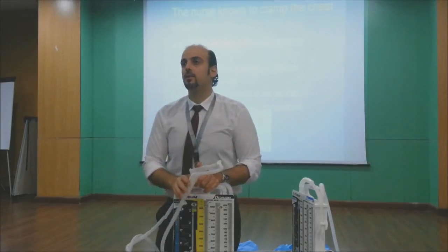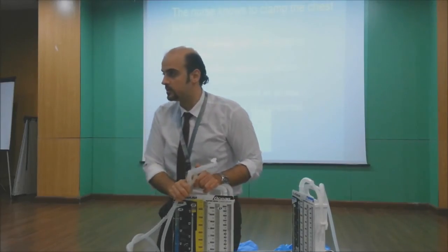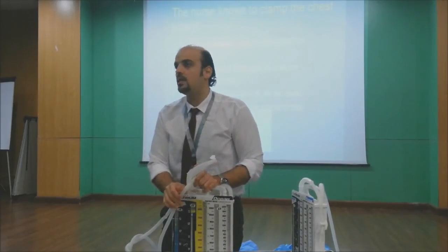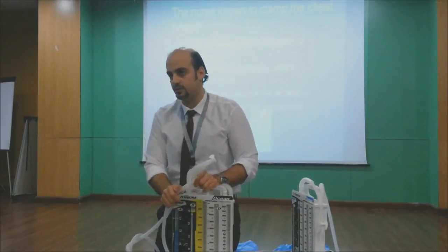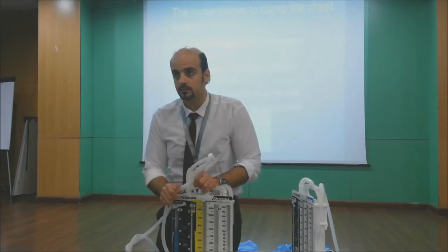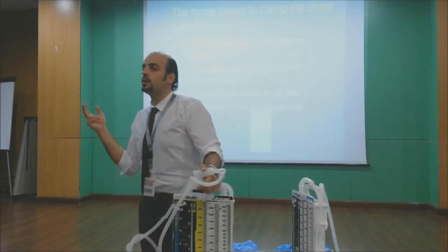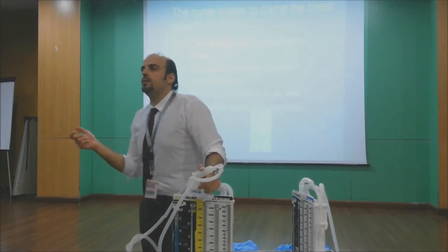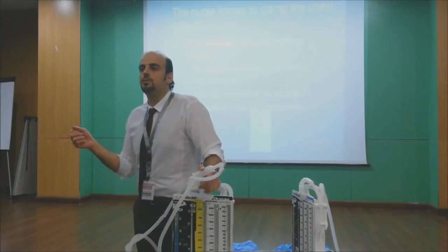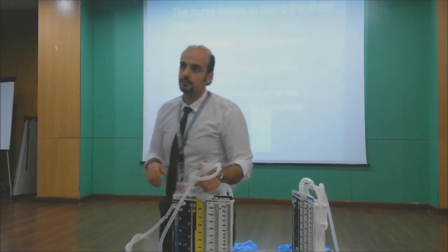Even here, because this is invasive, there are a lot of complications of insertion of this tube. I saw many patients die from insertion of a chest tube. Died. Okay? A chest tube can go into the lung, can go into the heart, can injure the lung. A chest tube is a very risky procedure in non-expert hands.